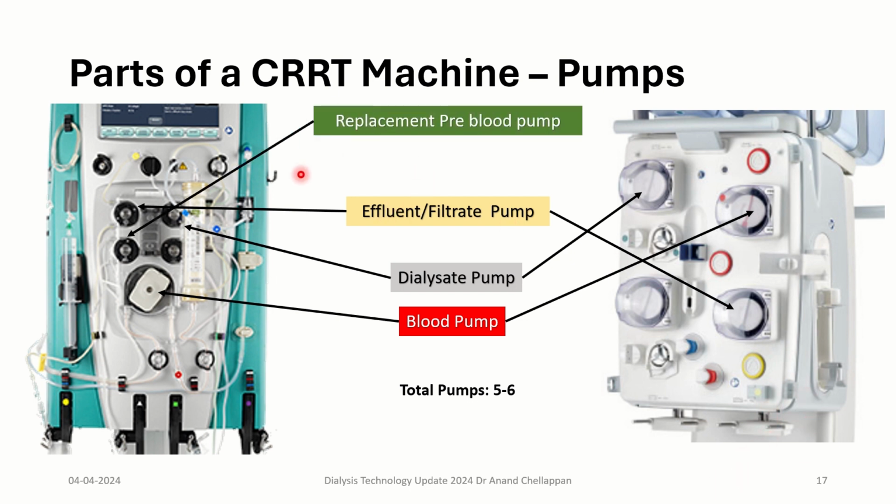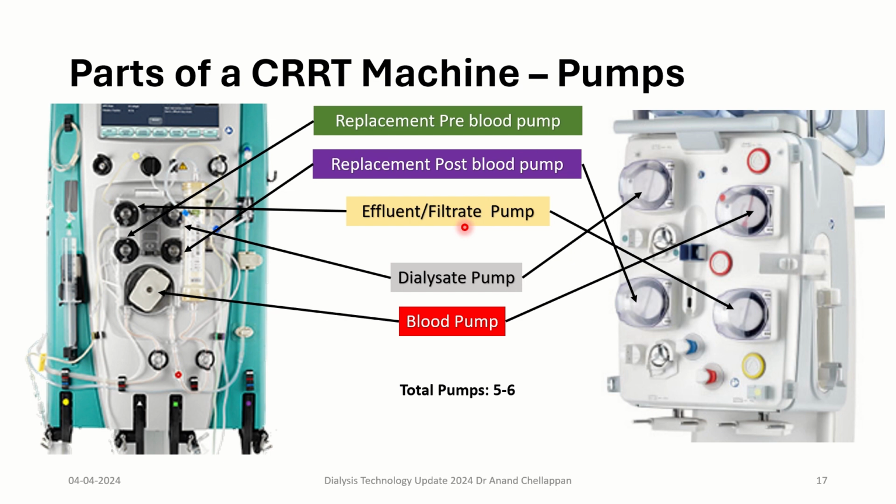Then we have the replacement fluids. Now, replacement fluids are used in convective therapies, hemofiltration, CVV hemofiltration and CVV hemodiafiltration. So they can be given either before the filter or after the filter. So you have to have pumps to give it either pre or post blood pump.